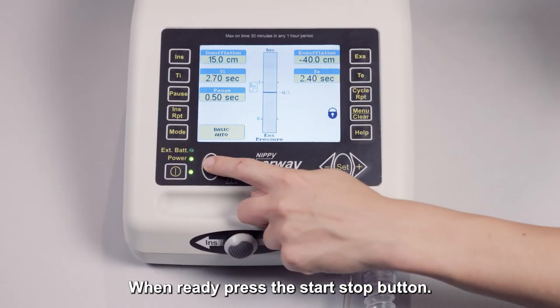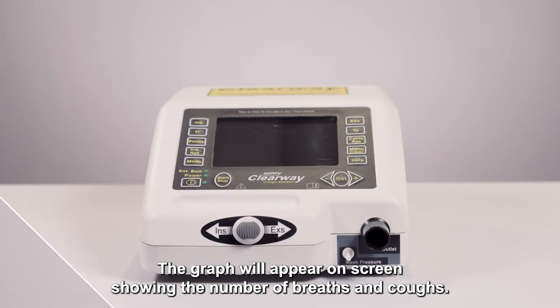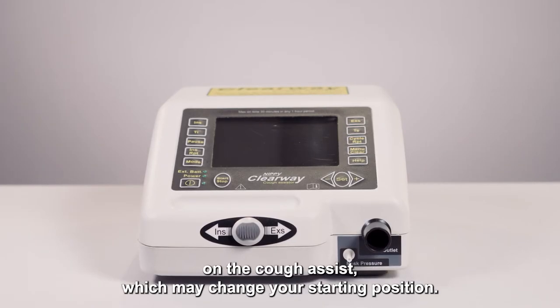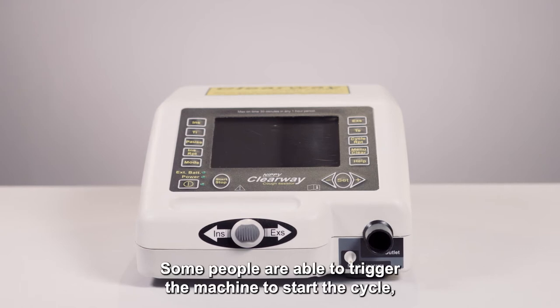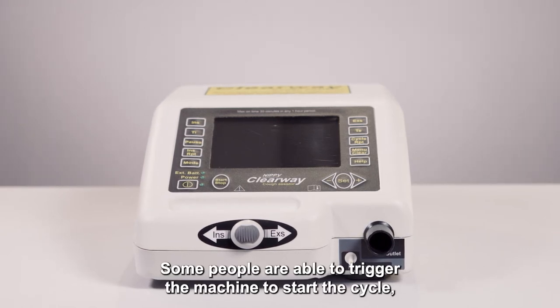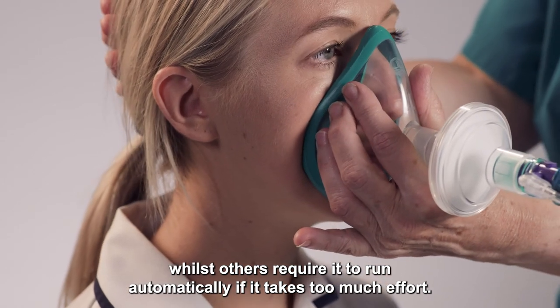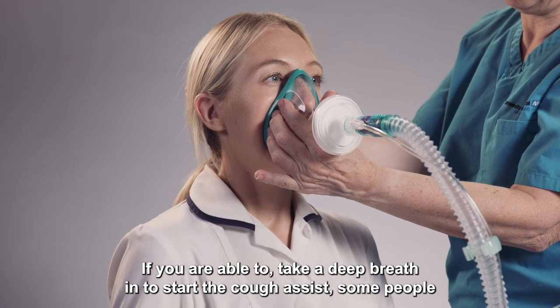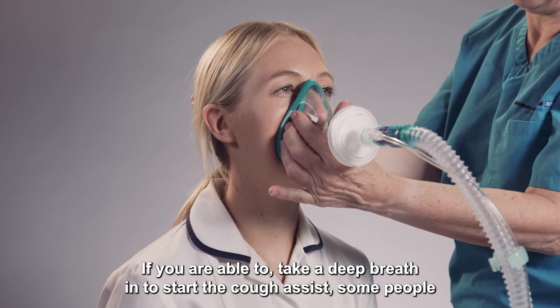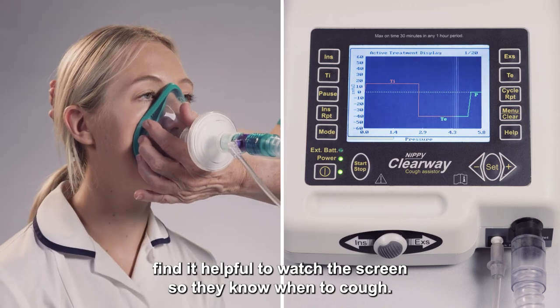When ready, press the start/stop button. The graph will appear on screen showing the number of breaths and coughs. There are different modes which may change your starting position. Some people are able to trigger the machine to start the cycle, whilst others require it to run automatically if it takes too much effort. If you are able to, take a deep breath in to start the Cough Assist. Some people find it helpful to watch the screen so they know when to cough.